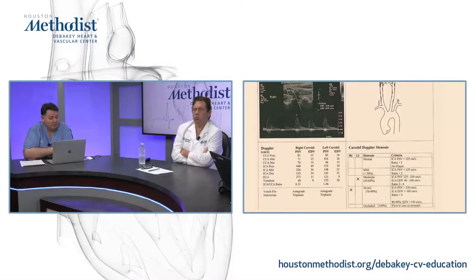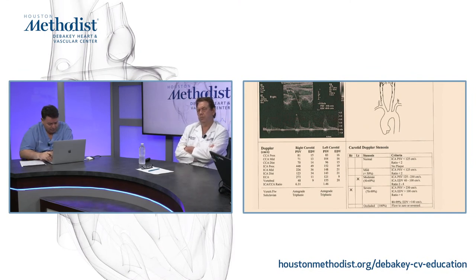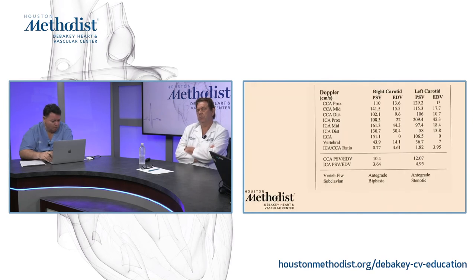So that X is a manual production of one of my coworker, and this is where we come in. The interpretation is really something that we need to edit, maybe the prelim findings, but the prelim is already provided by the sonographer. And I will show you a full study.